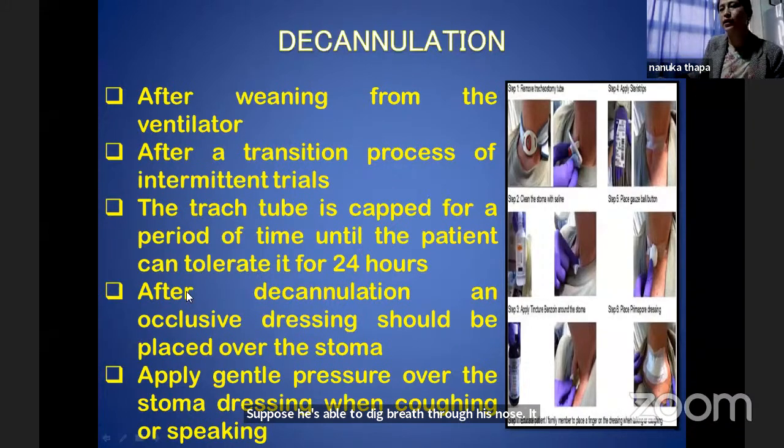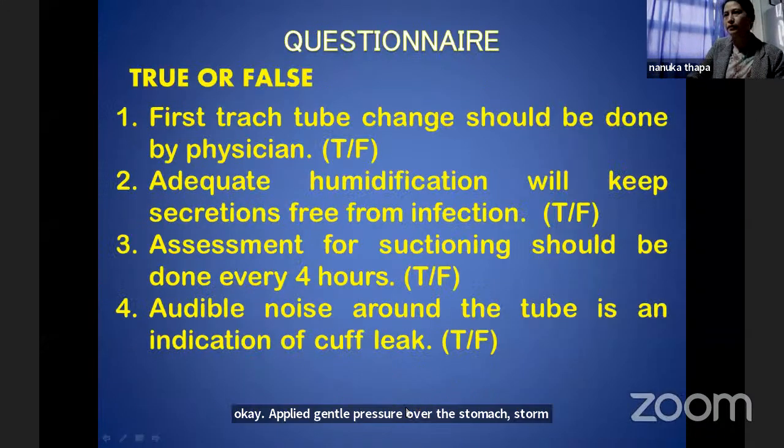These are the trials. Then after decannulation, an occlusive dressing should be placed over the stoma. As you can see in this diagram, once the trach tube is removed, an occlusive dressing like this is placed over the stoma, okay? Apply gentle pressure over the stoma dressing when coughing or speaking.